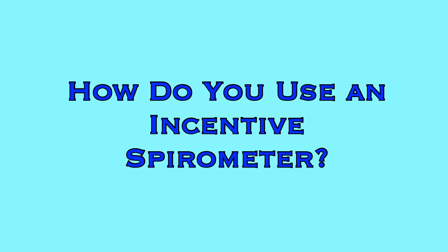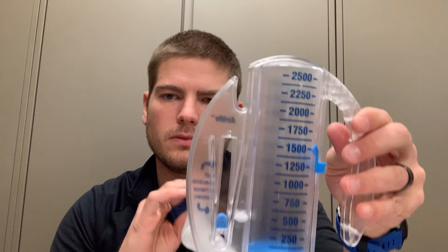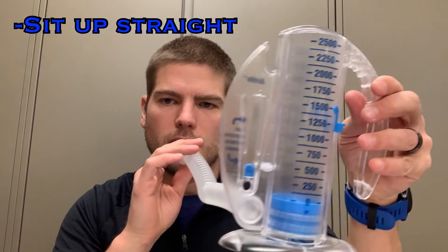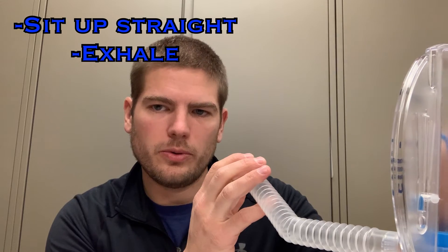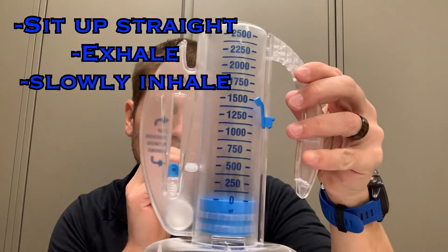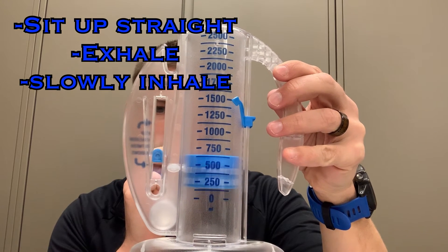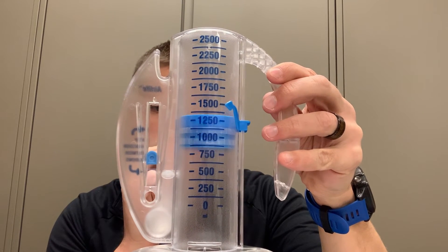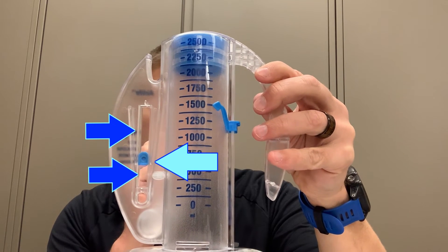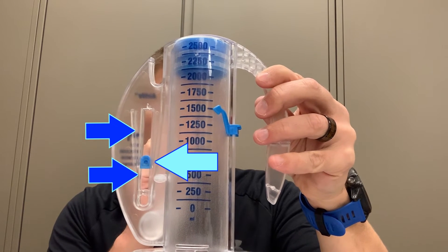So how do you use an incentive spirometer? First, have the patient sit upright — this is a good position to aid in lung inflation. Before they inhale, the patient should exhale to empty their lungs. Then with their mouth sealed over the mouthpiece, slowly inhale until they can't take in any more air. While inhaling, they want to float the tab on the right of the device between the indicator arrows, showing they are inhaling at an appropriately slow and steady rate.